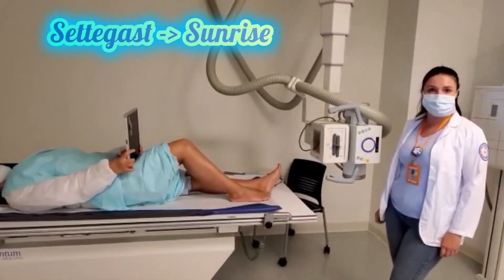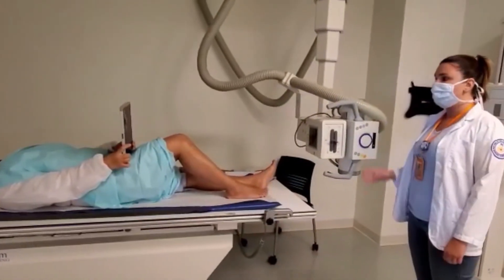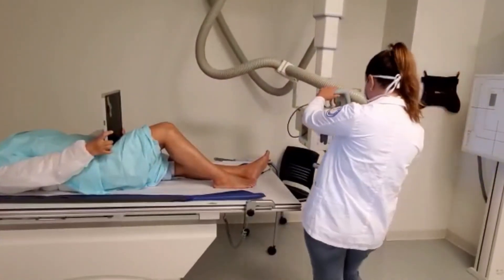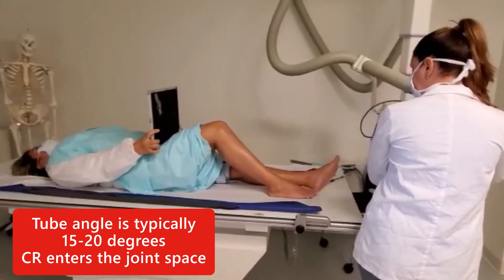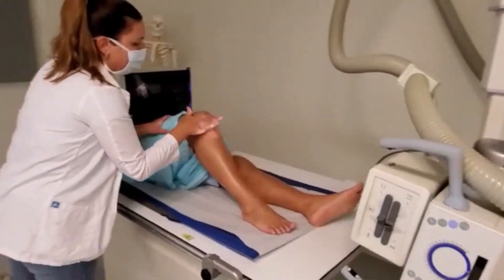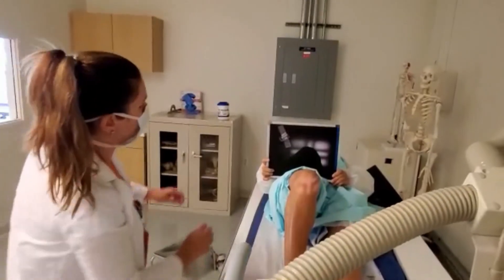In this case, we are going to be doing the Settegast view, which we also call the sunrise view, to image the patella. The patient is supine and will be holding the IR. The knee is flexed until the patella is perpendicular to the IR. We are going to increase the SID since we have a lot of OID. We will angle the tube 15 to 20 degrees, entering in the space between the patella and the femoral condyles. Don't forget to collimate and use your marker.